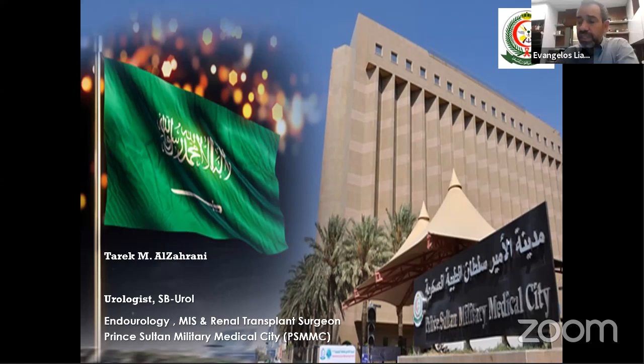Now, one of the big differences that we have made in our practice in the latest years is that we are doing a big study right now and we're trying to create a nomogram. For me, one of the biggest tools that I have doing PCNL is the ultrasonic probe. So anything that does not use an ultrasonic probe is delaying the case for me. But at the moment, we are using either the conventional scope, which is a 26 with a 30 French dilation, or the 18 French scope from Storz with a 20 or 22 dilator. How do we decide which one we will use? When we do the retrograde, we see the anatomy of the calyces. And if the anatomy of the pelvis and the calyces is small, we use a smaller scope. So this is the change that we have made. And at the moment, we are also doing studies to prove the non-papillary puncture with a smaller scope.